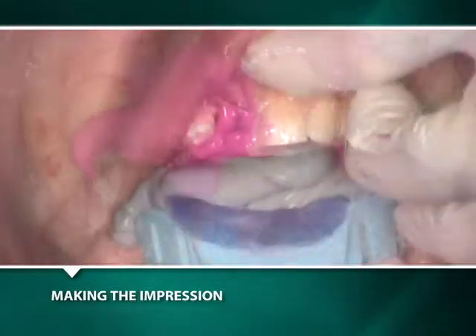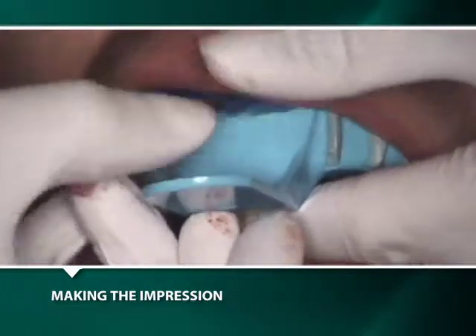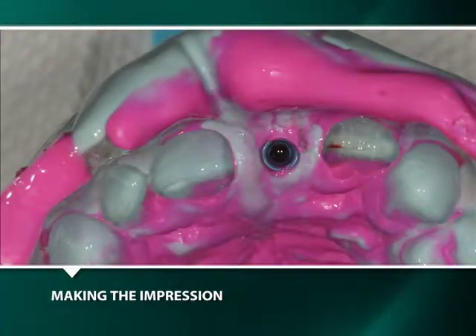Upon removal of the full arch impression, the blue plastic sleeve was appropriately retained in the impression and the blue metal impression post was retained in the well of the implant.